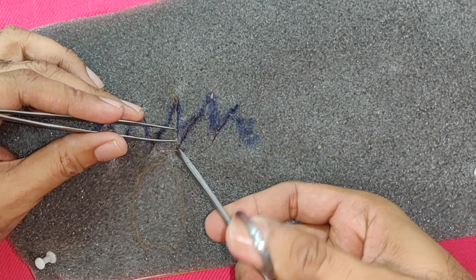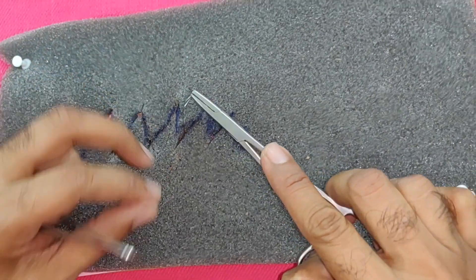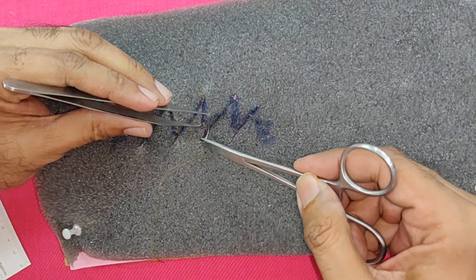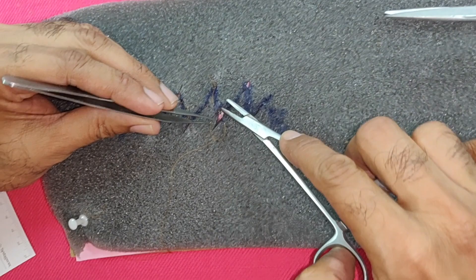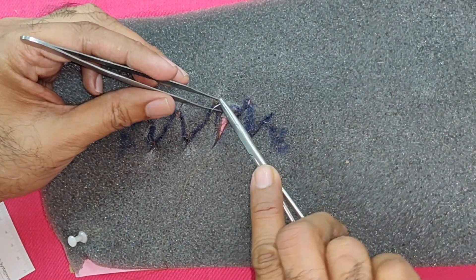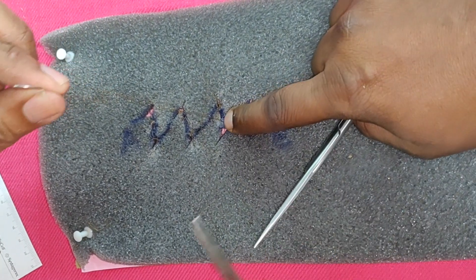Now we will suture it. All the suturing is done. Just remember when you are doing the suturing on this practice sponge, you need to take a thick bite. Don't think of approximating the edges like you would in a real case — just put a gentle suture so that you don't pull out the suture, because the sponge is very soft and it tends to cut through.